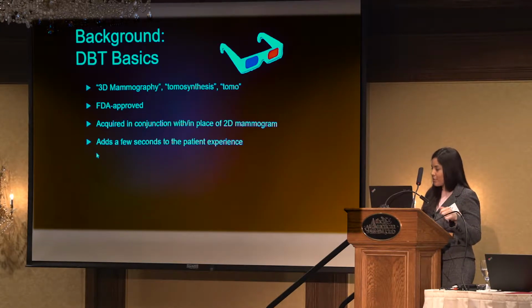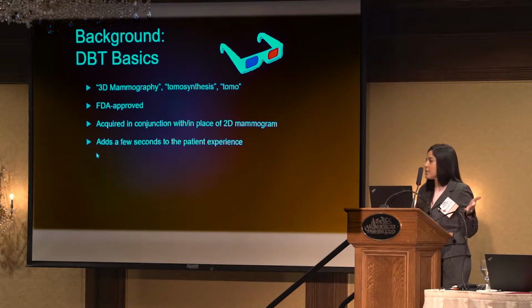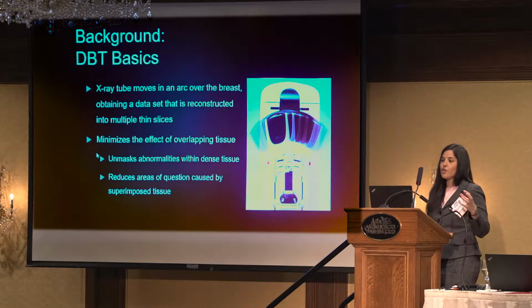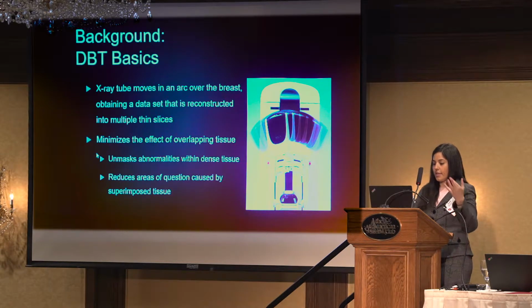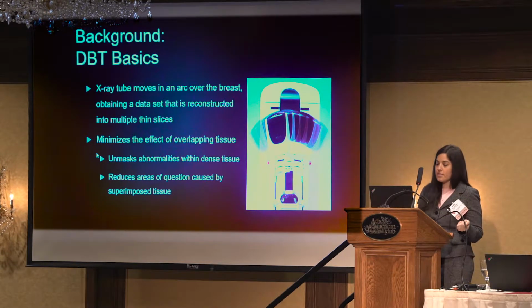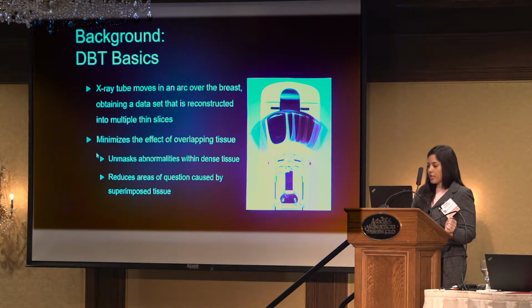It is FDA approved. It's acquired either in conjunction with or in place of a 2D mammogram, and really it adds a few seconds to the patient experience. So various vendors have all created different solutions to how tomosynthesis works, but essentially they all do the same thing at the core, kind of dumbed down to my level, where they acquire a series of low-dose exposures at varying angles, and these individual source projection images are then reconstructed into a series of thin, high-resolution slices, which are typically about 1 millimeter thick.